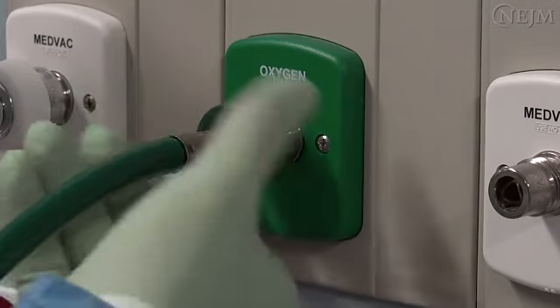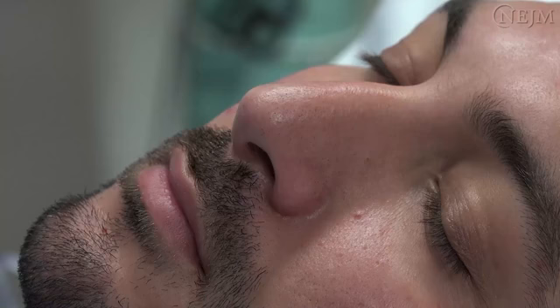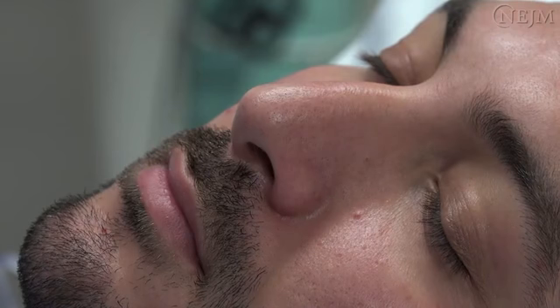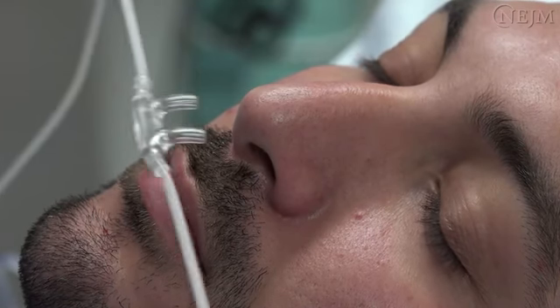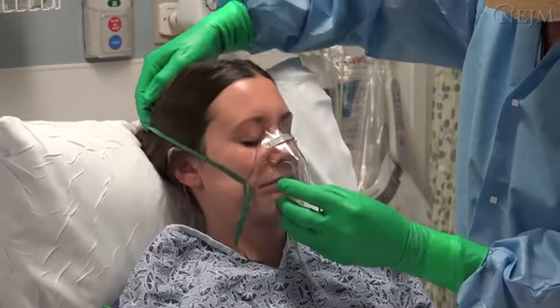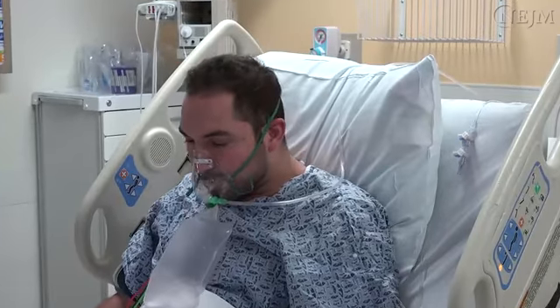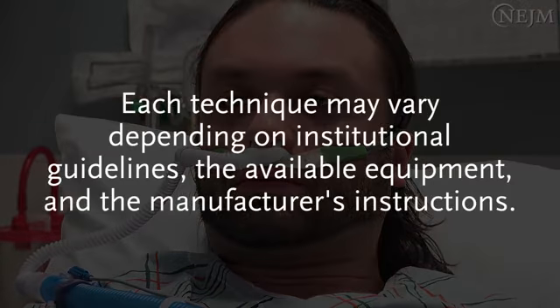Supplemental oxygen is commonly used in modern medicine and is fundamental to the treatment of hypoxemia. This video focuses on the administration of supplemental oxygen in adult patients in an acute care setting through a nasal cannula, simple face mask, face tent, Venturi mask, non-rebreather face mask, or high-flow nasal cannula. Each technique may vary depending on institutional guidelines, the available equipment, and the manufacturer's instructions.